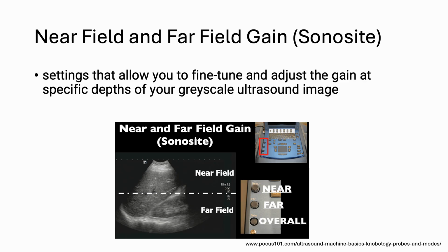And so you can adjust the gain on this, which is showing the Sonosite. So not all ultrasounds have this. They may have a variation of this. And then you can also adjust the gain overall.